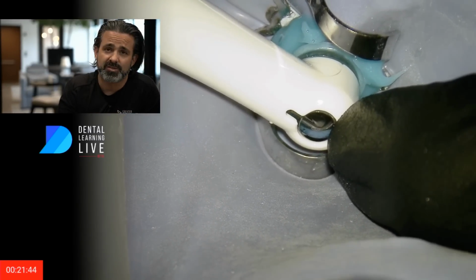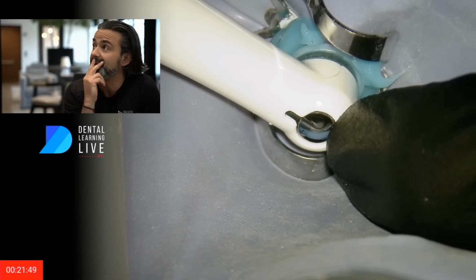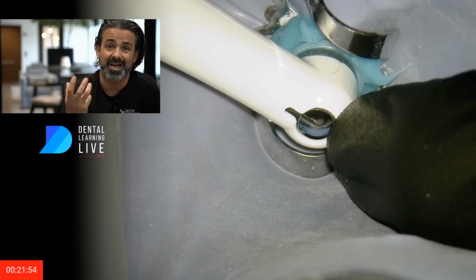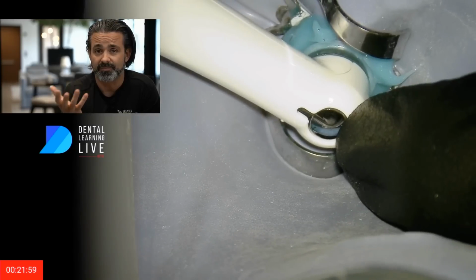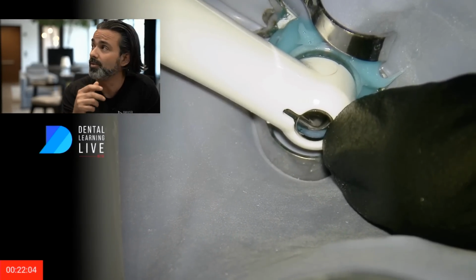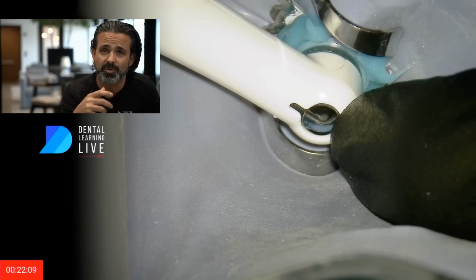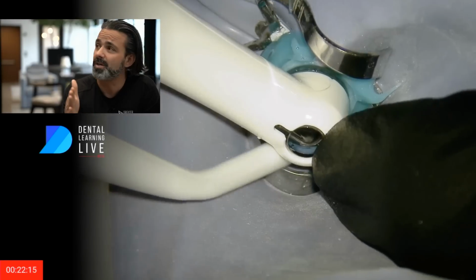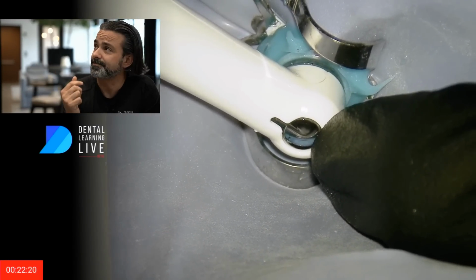And that's one thing that allowed me to make the decision of going into the GentleWave, because I could spend 15, 20 minutes at times, maybe even longer, trying to negotiate down there in a high-risk scenario, where I could potentially break the file. As I keep getting heavy-handed, the longer it goes, it seems like we just work and work and work, picking around, and I didn't want to do that. Now that I've gotten so comfortable and I've had so many cases with the GentleWave, this actually speeds things up and keeps me on point. Hence the reason for using the GentleWave.